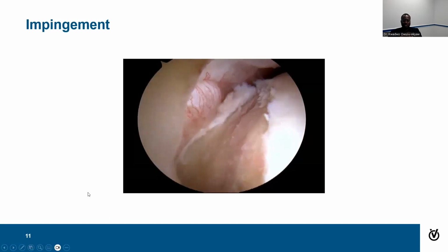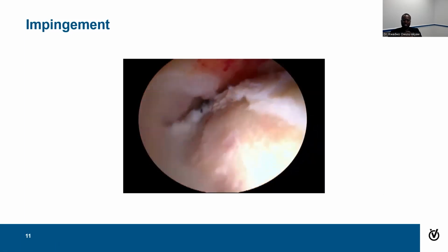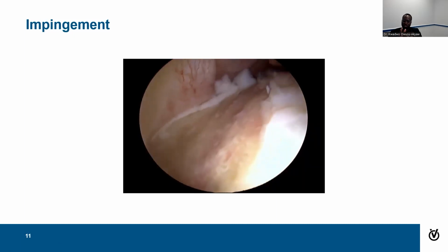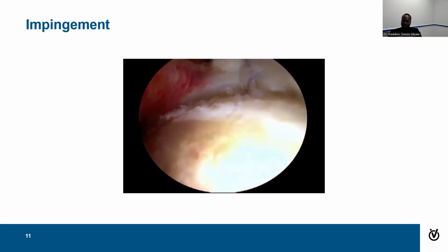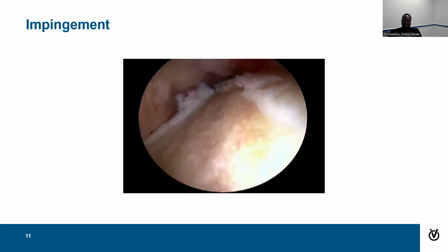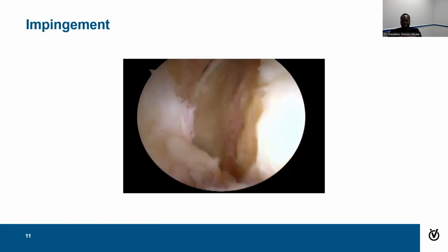And here we are having completed our smoothing, and we're moving the hip around, and we're making sure that nothing's catching on the labrum. The labrum is on your top right in this picture, so you can see it up there. One of my stitches is kind of in the view. You see how nothing's catching on it? It's going nice and smoothly. That's how we know we've done the appropriate task. We've done what we needed to do. We've taken enough bone, and we're going to be okay.